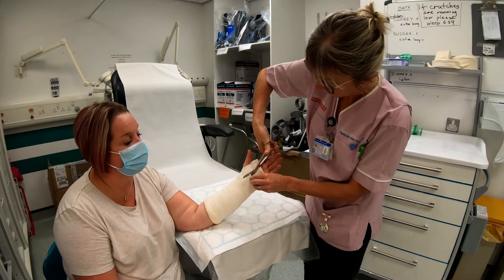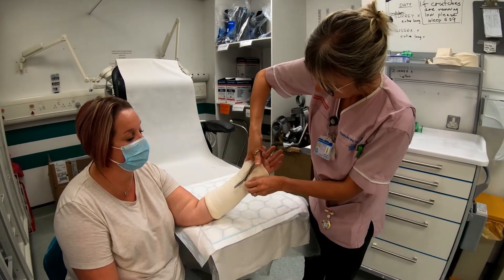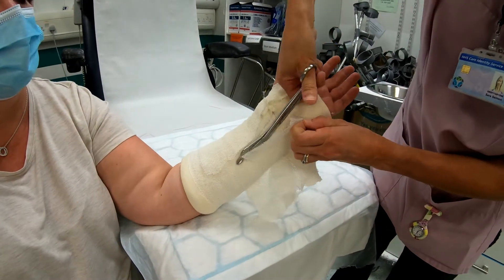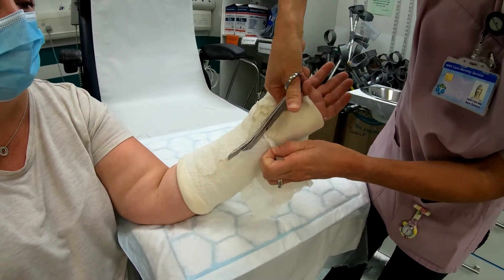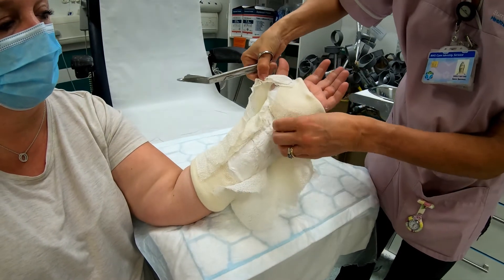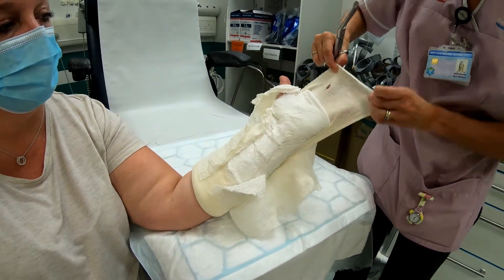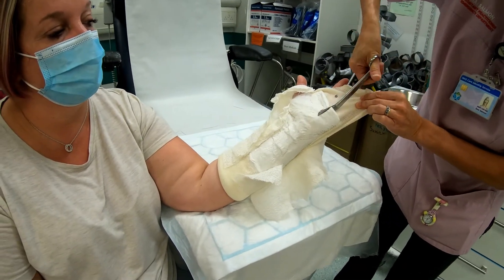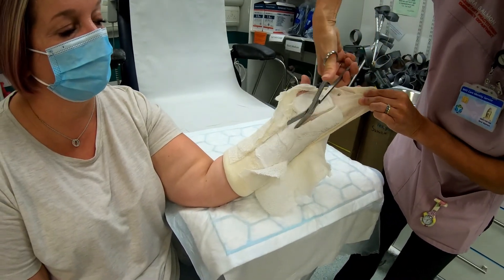They might think they're going to get nicked by the scissors, so make sure you take the bandage off first. Cut it off first, and then if you pull the sock back, you can use that as your protection to the skin while you work on the soft material.